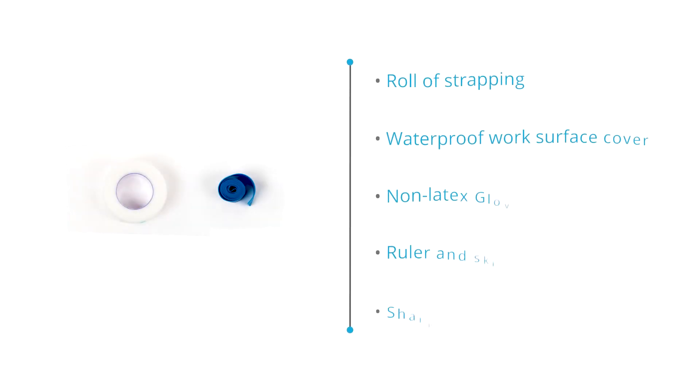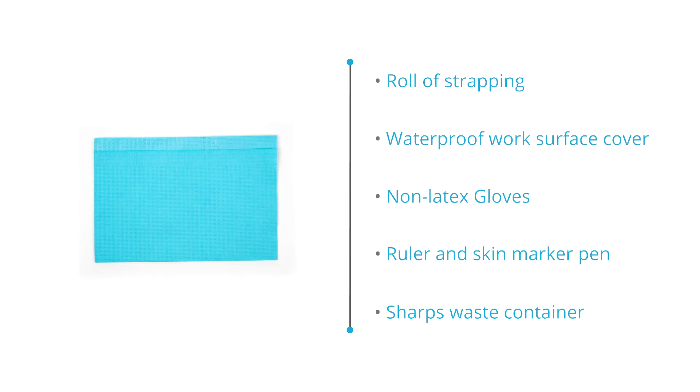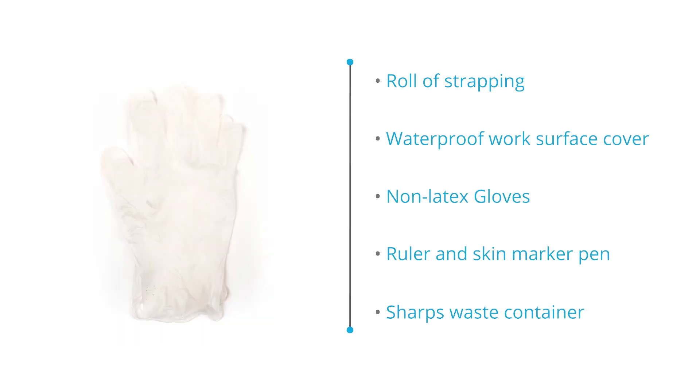Dressing, alcohol prep swabs, clean gauze squares, and cotton swabs for cleaning or as a dry dressing. A roll of strapping to secure dressings or IV tubes, waterproof work surface cover, non-latex gloves, ruler, skin marker pen, and a sharps waste container to safely dispose of potentially hazardous items and materials.